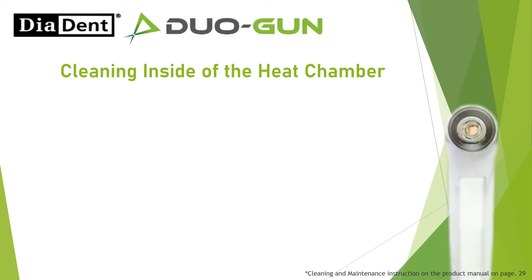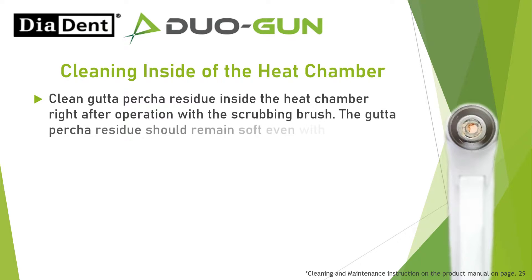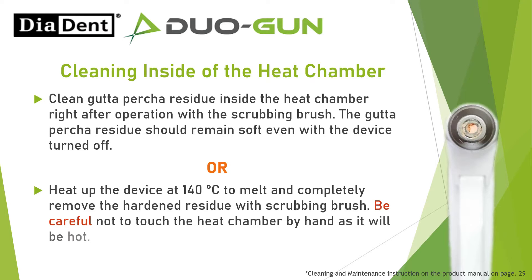Cleaning inside the heat chamber: Clean gutta-percha residue inside the heat chamber right after operation with the scrubbing brush. The gutta-percha residue should remain soft even with the device turned off. Heat up the device at 140 degrees Celsius to melt and completely remove the hardened residue with the scrubbing brush. Be careful not to touch the heat chamber by hand, as it will be hot.